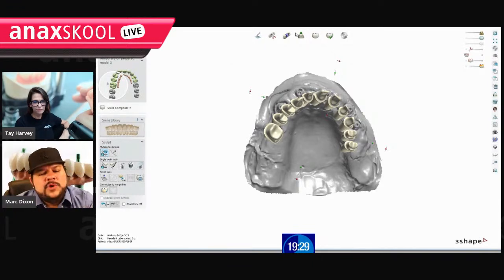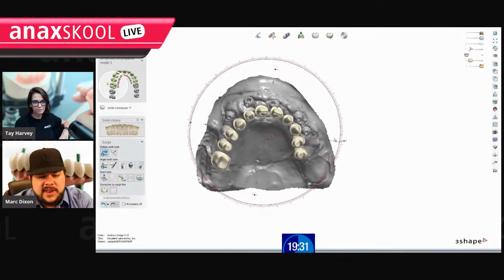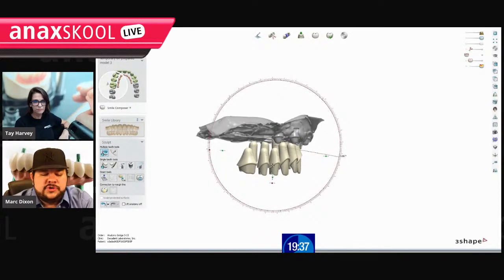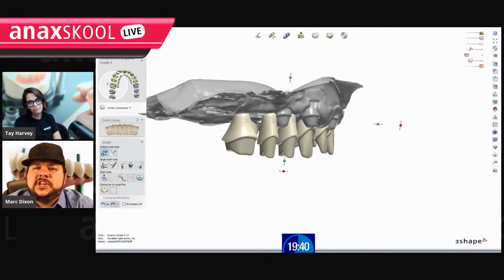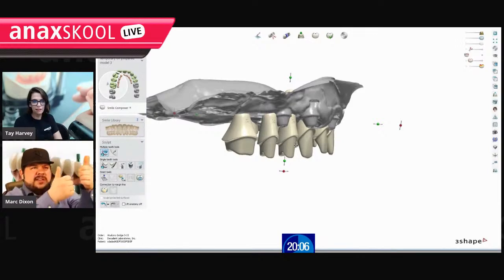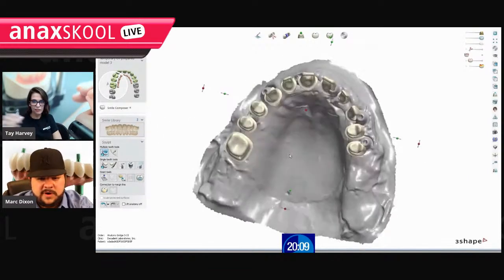Let's pretend. But when you have this library and you're going to position everything real nice, the problem with attachments, even though it works just fine, is that even when you don't choose global position, but you choose to place them all individually and apply them at once, they move. If you move one, they all move. So you have to put one down real nice where you want it and apply it before you can put any more. It's a pain, because maybe I just want to keep moving things around so they're all right where I want them before I tell them to drop. Individual adjustments, yeah.